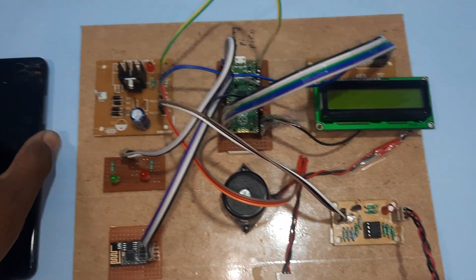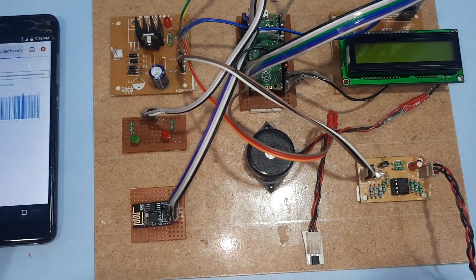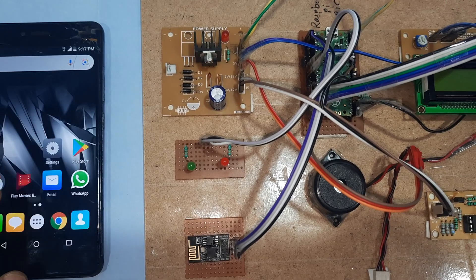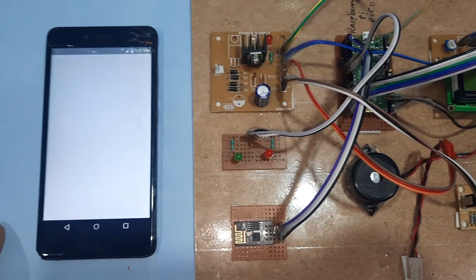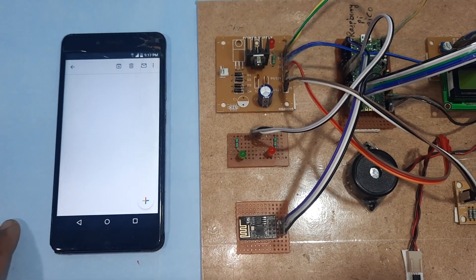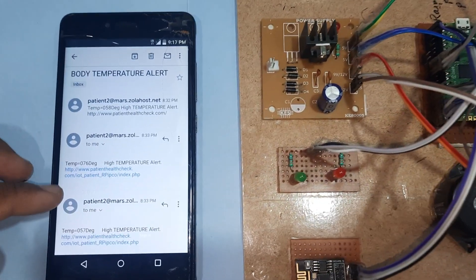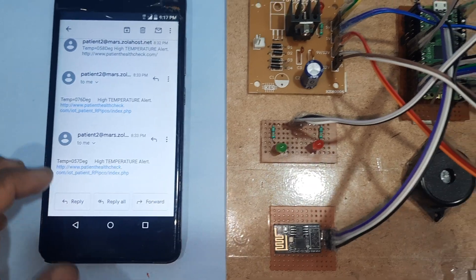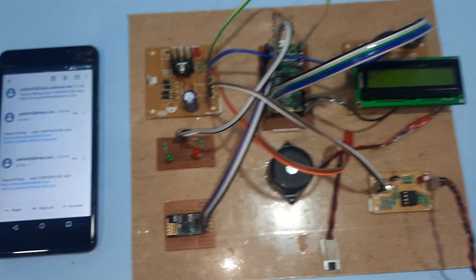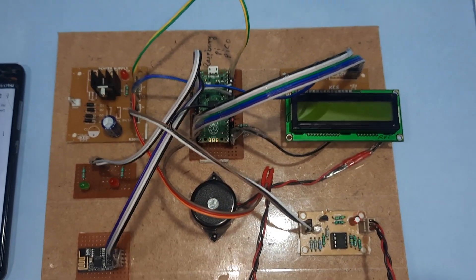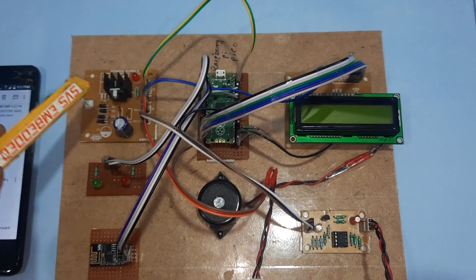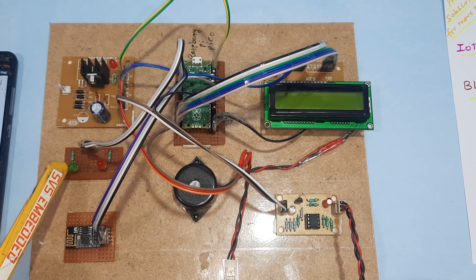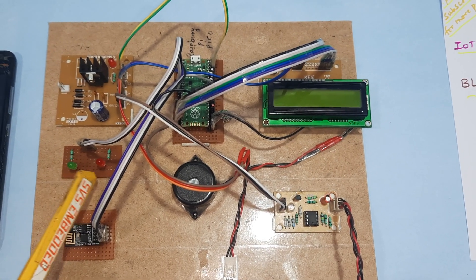We are using an IoT web page, PHP, MySQL database, and email alerts. We are also getting email alerts — for example, body temperature alerts. The power supply section uses a bridge rectifier, filter capacitor, 7805 voltage regulator, one red LED, and one green LED.